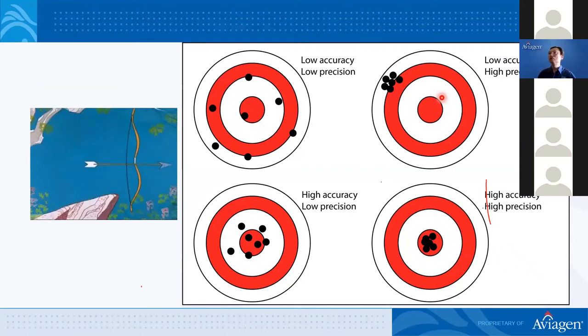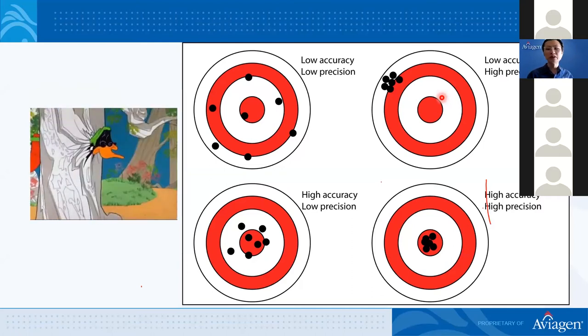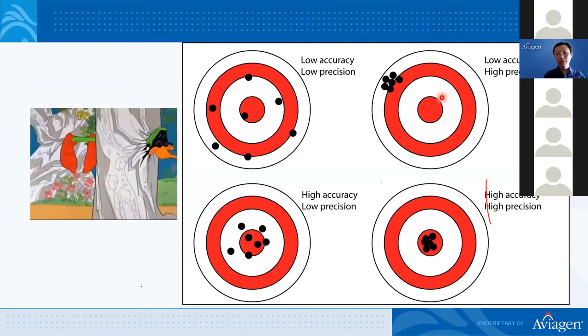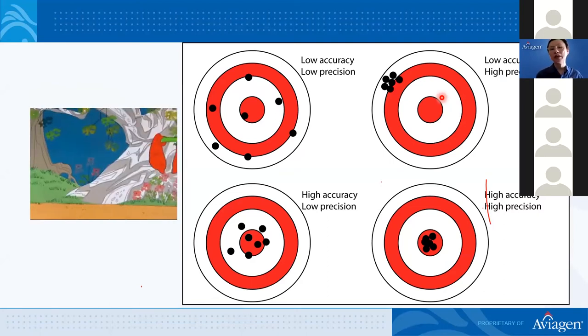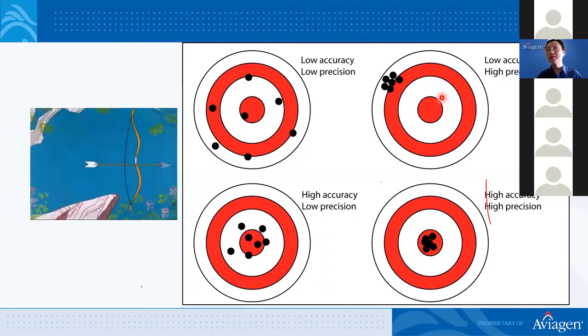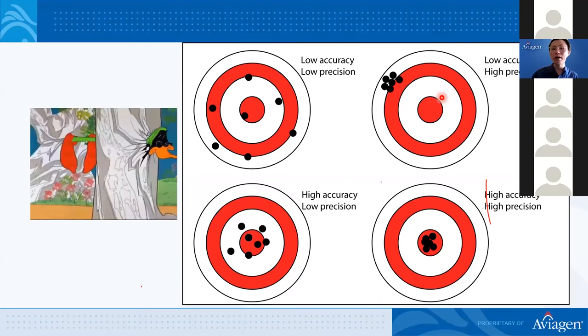Talking about good serology tests, I am always looking for high accuracy and precision because I want to know the real situation. But in real life, we are not perfect. Okay. Nothing is perfect in this world because it's created by humans. But we can always find a better one. Okay. So a good test system or test kit can always be your confidence because they always have a good quality system embedded in the test.